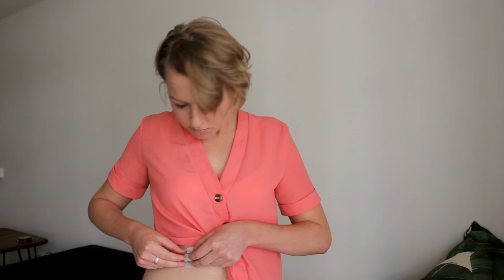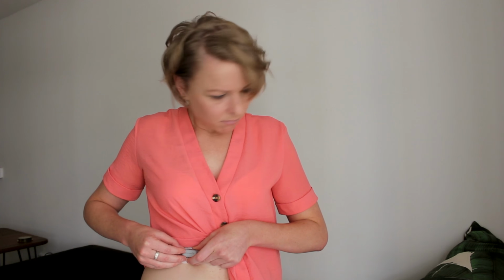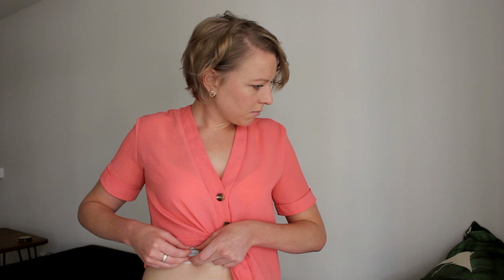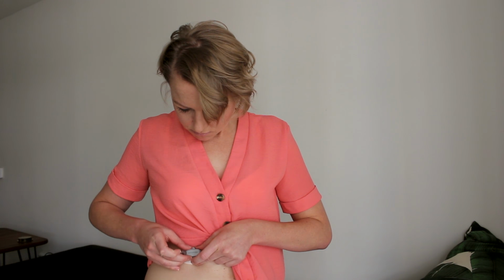Solid. Great weather we're having at the moment, right? You may want to pinch up on your skin at the front tips of the white adhesive. Use a finger to hold the transmitter in place. With your other hand, move the transmitter latch forward until you hear 2 clicks. This may take some force.